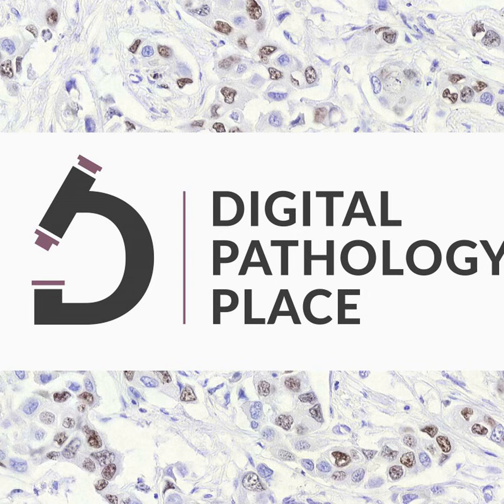And it falls really well into image analysis because image analysis is generating a lot of different metrics with each image. It's not just expression. It could be things like nuclear shape, nuclear size, cell morphology, cell size. So there are a lot of features that get extracted out of an image analysis algorithm. And you never know, one of those might be important for correlating with outcome. There's never a guarantee that you're going to find this biology in there. But if you don't look, then you're not going to find it. And here they did look enough to find something that was better than just a visual cutoff.